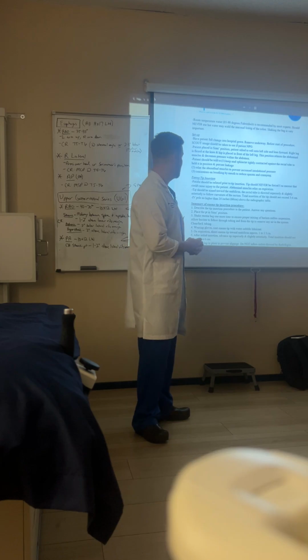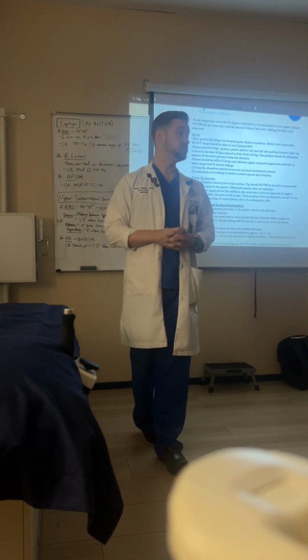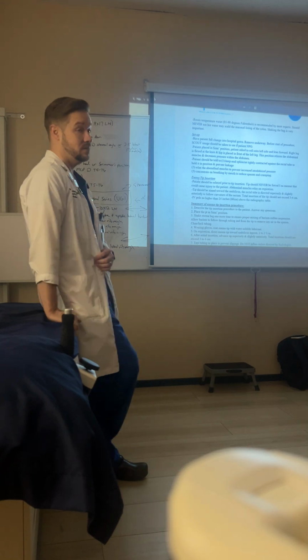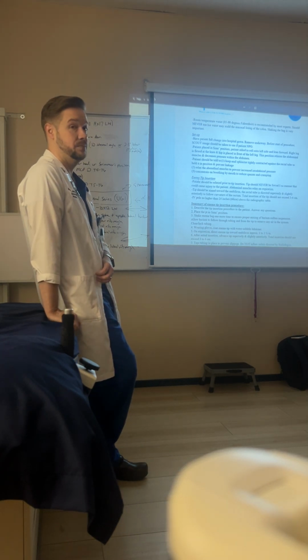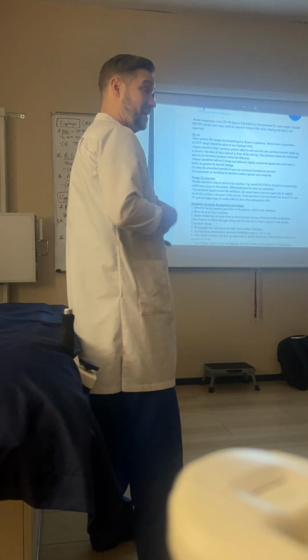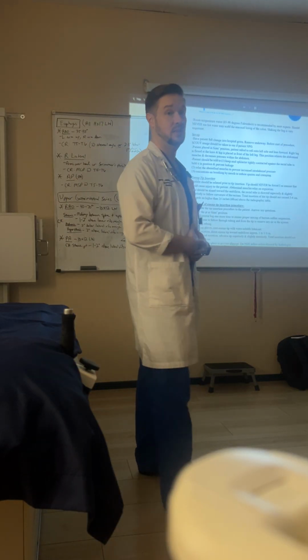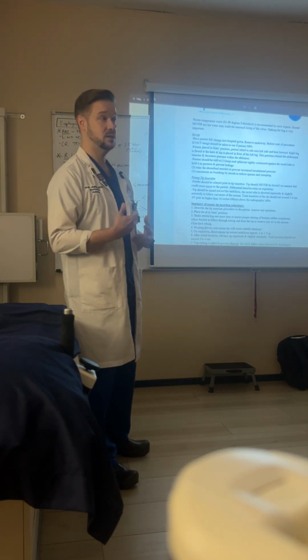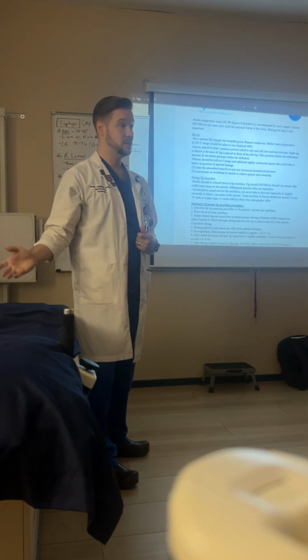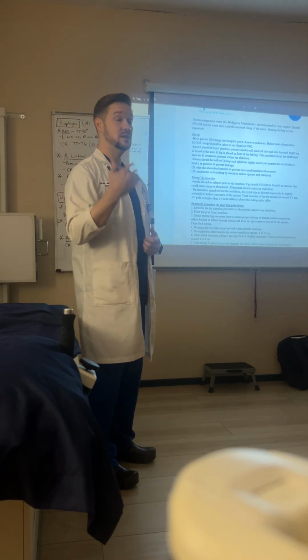They're going to relax their abdominal muscles during the procedure to prevent increased intra-abdominal pressure. The BE is an uncomfortable procedure, period. We're putting a bag full of fluid into their abdomen, and we're also giving them gas sometimes. They feel a lot of pressure in their abdomen, and they will probably complain about the discomfort the entire time. So, as with every other procedure, but especially for the BE, our job is what?